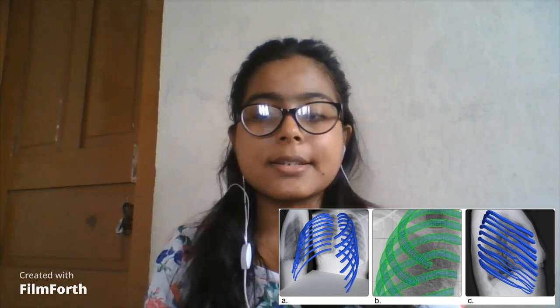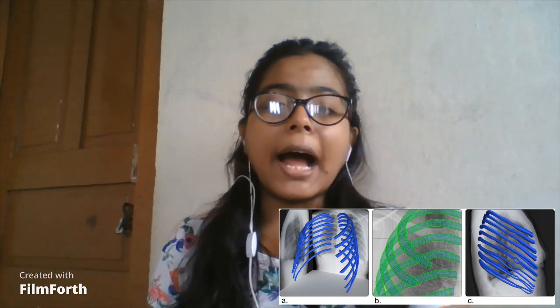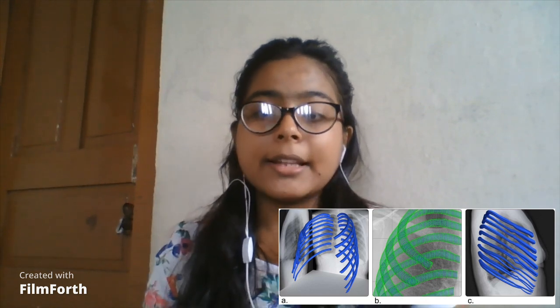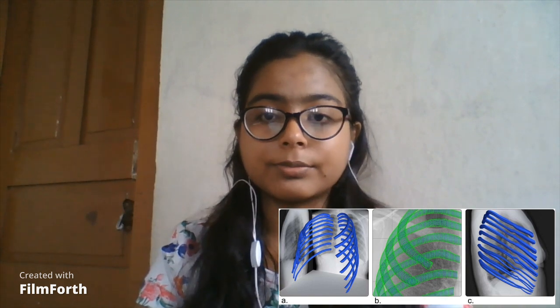The lateral cluster is then rotated around the Z axis so that the angle matches the angle between the two vertices of the template with the maximum and the minimum Z coordinate. This is the last set of transformations, as shown in the figure.